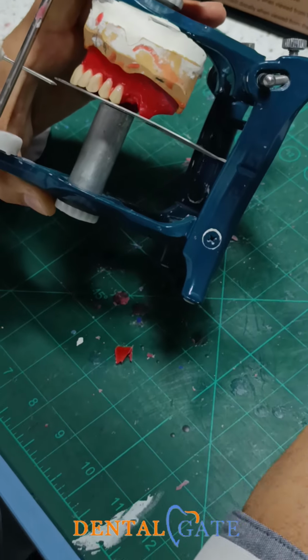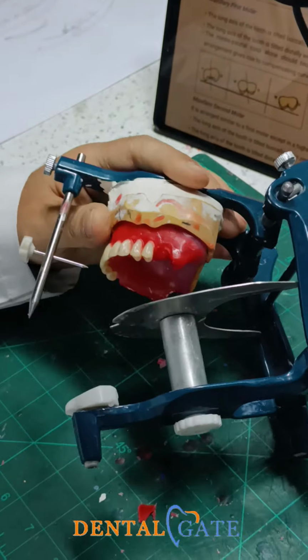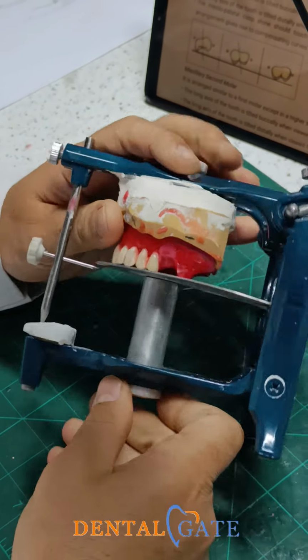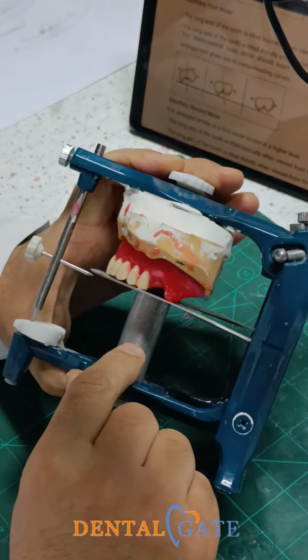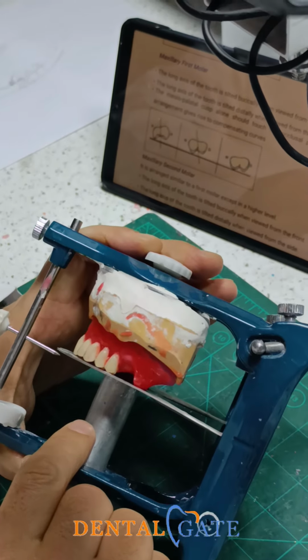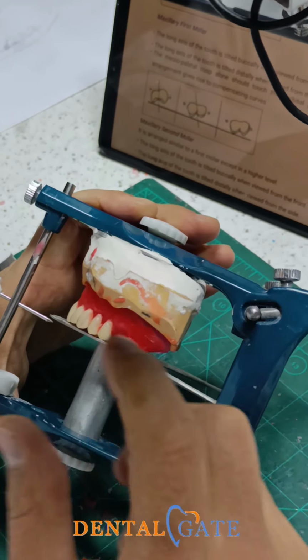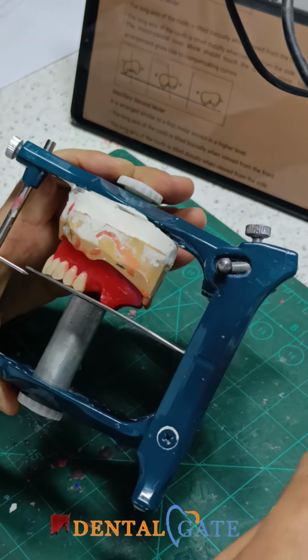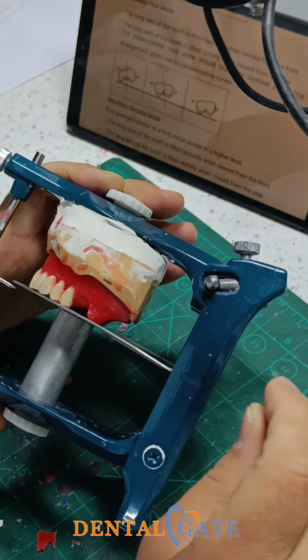So make a sufficient room for the molar. Be sure the wax is clean, with no contamination within the wax. It will be assessed to preserve good occlusion, good adhesion to the teeth.